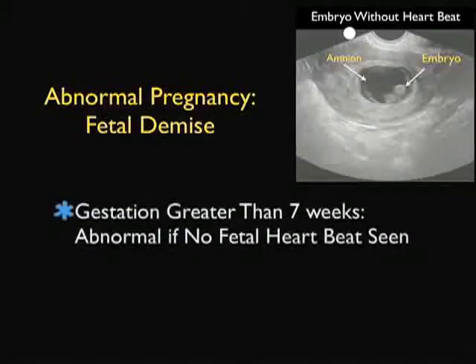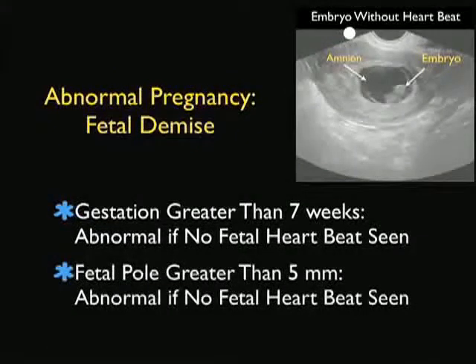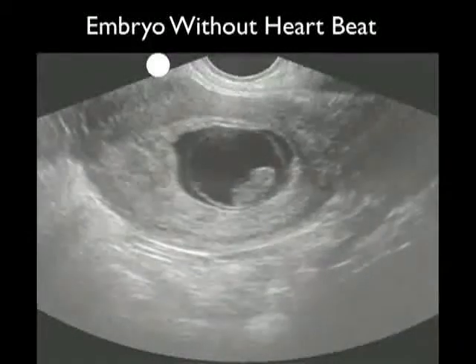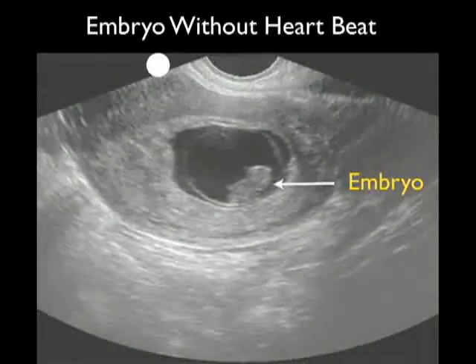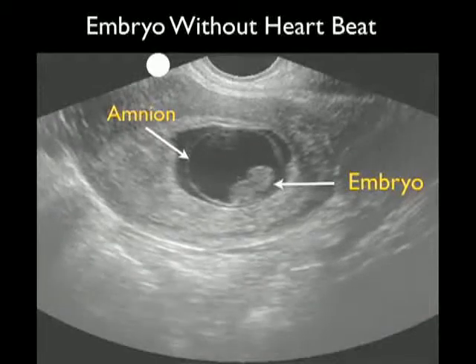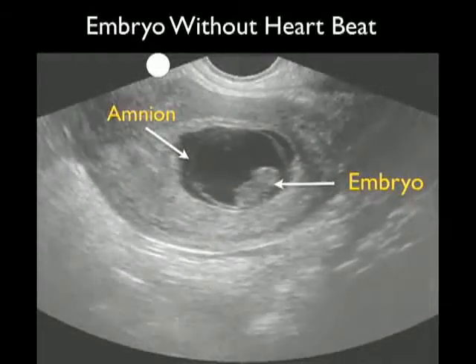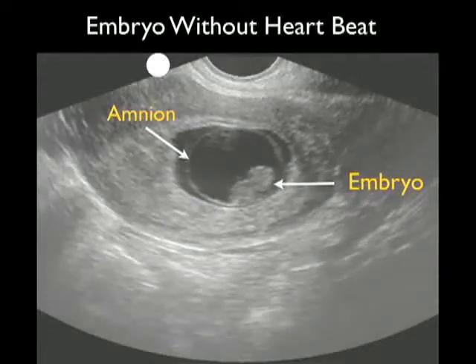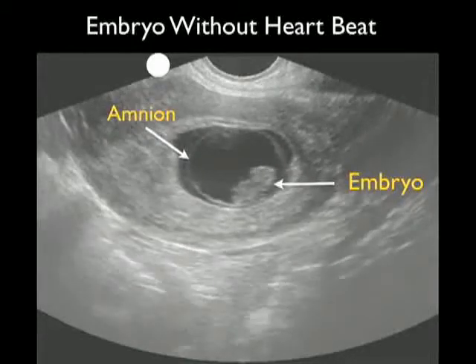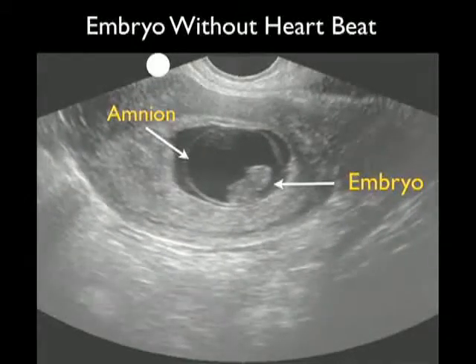Other indicators of abnormal pregnancy with fetal demise include a gestation greater than 7 weeks with no fetal heartbeat, and a fetal pole greater than 5 millimeters with no fetal heartbeat. This was an unfortunate case showing a large fetal pole greater than 5 millimeters without a heartbeat, indicative of embryonic demise. We also see a large circular amnion within the gestational sac. While it's important to pick up these findings, I always get a confirmatory ultrasound and/or OBGYN consultation before giving the patient the news of fetal demise.